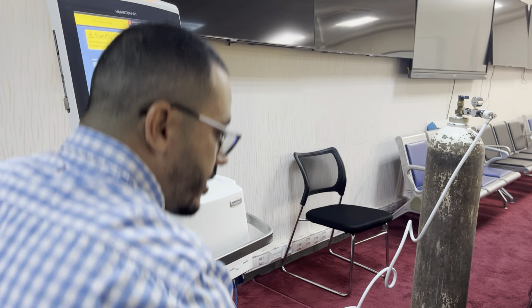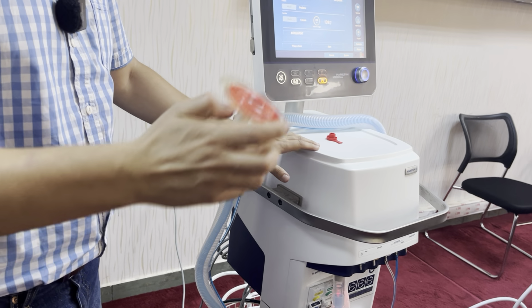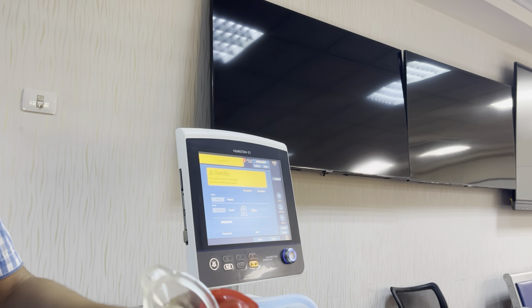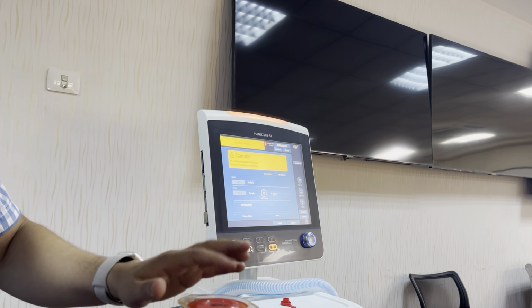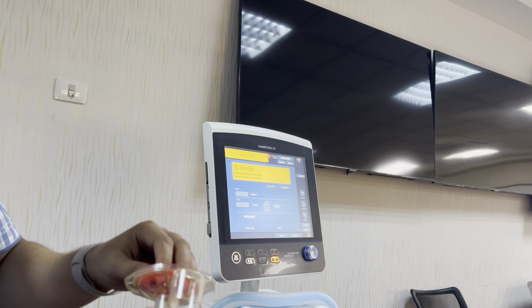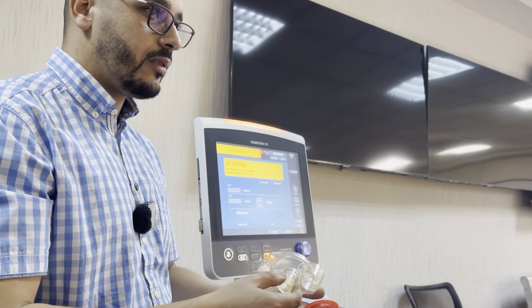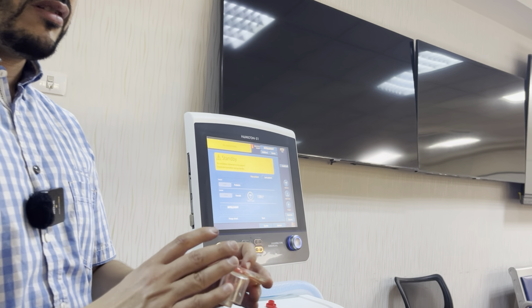After the patient is discharged, we throw away all the disposable circuit with the flow sensor, but we have to clean and disinfect the expiratory valve and membrane, because this part is contaminated with the expired air. So we have to remove it, wash it, and use any type of disinfectant. Even if contaminated by TB or multi-resistant organisms? Yes, even by TB.